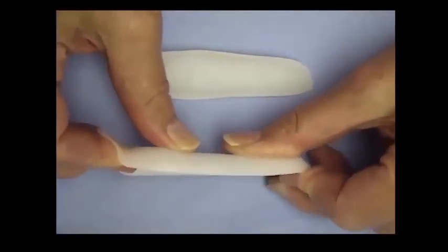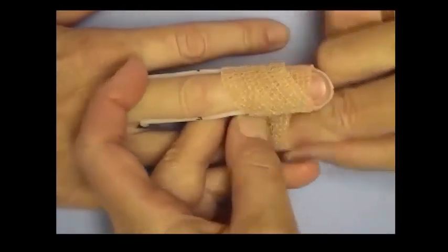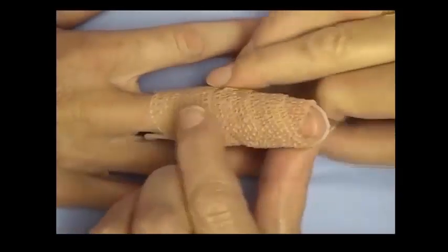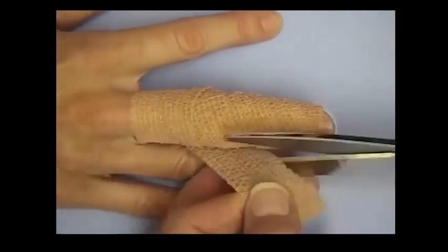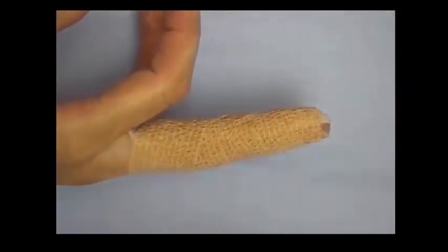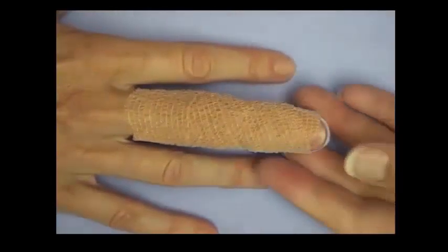This example uses a self-adherent elastic wrap which allows you to gently maintain full extension for prolonged periods of time, usually night wear. This is also an excellent way to reduce any residual edema by providing gentle but well-distributed pressure over the entire length of the dorsal finger. It is very comfortable to be worn all night and cannot be wrapped too tightly because of the mold. It can also be reapplied and removed a number of times before the self-adherent wrap needs to be replaced.